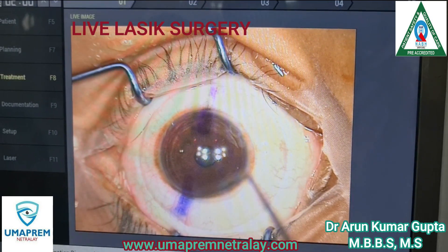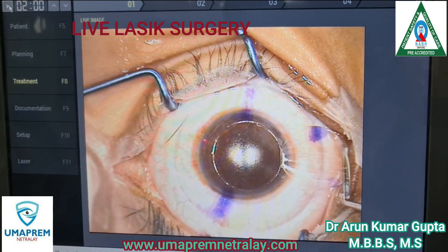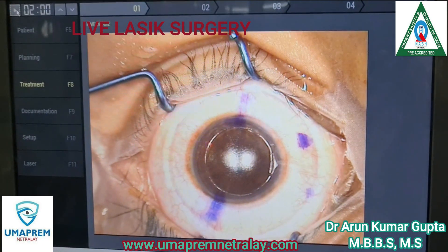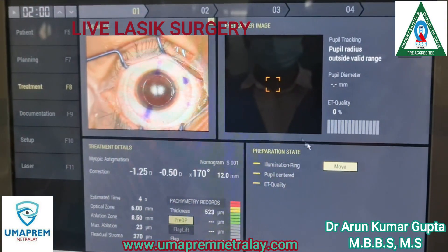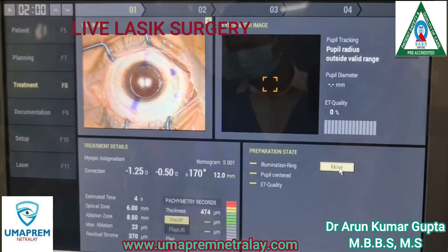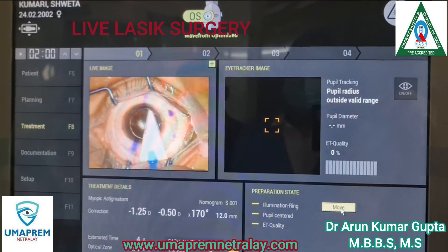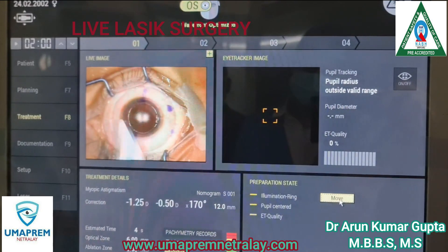Now the flap is elevated with the LASIK flap and spatula. The stromal bed is dried with a sponge. And here you can see the pupil tracking. The power is 1.25 and 0.5 cylinder.